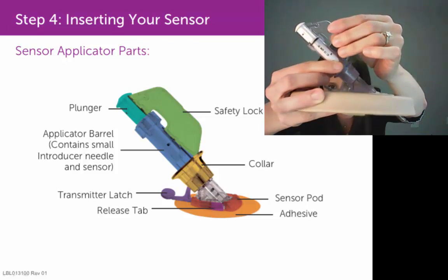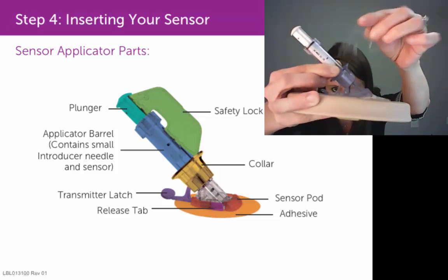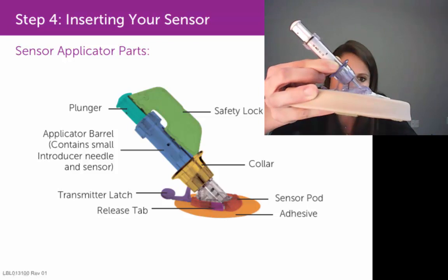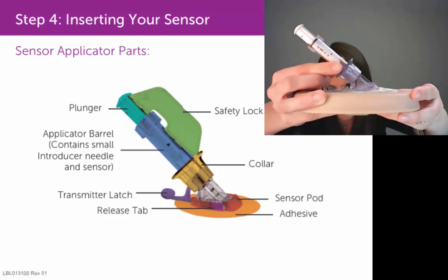you just pull that safety lock out and away from the applicator barrel. Again, put that safety lock in a safe spot so that you can use it in the future to help you remove the transmitter from the sensor pod.